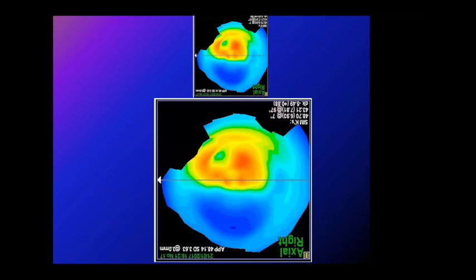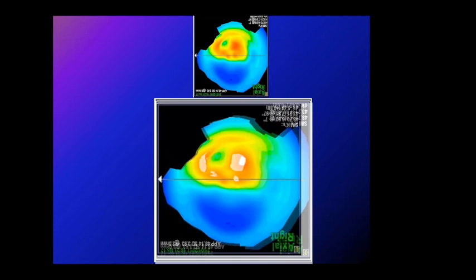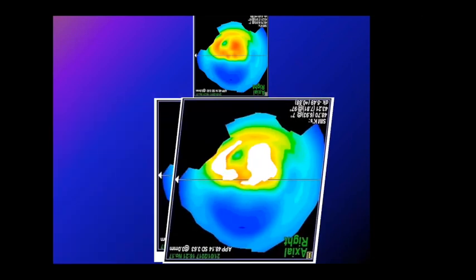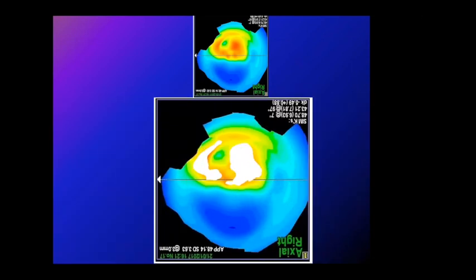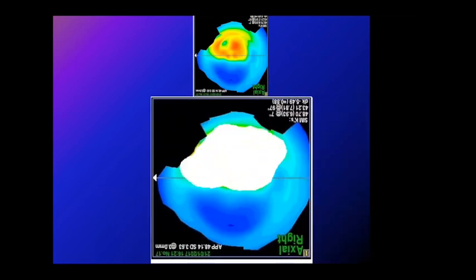Now this is just a diagram to show how the epithelium is lost. This is the first, the high part, and then the bigger part. As long as you are exposing more and more laser, until it removes it all. So it takes it like mountains, the higher part taken first.